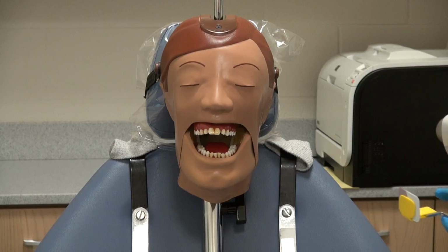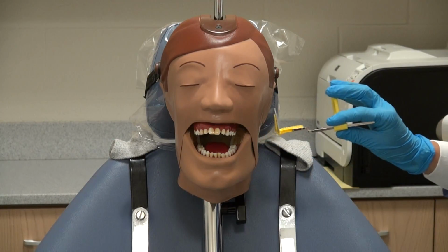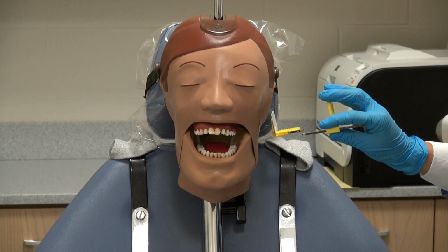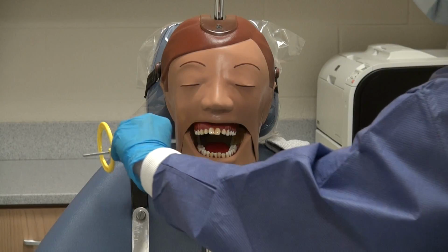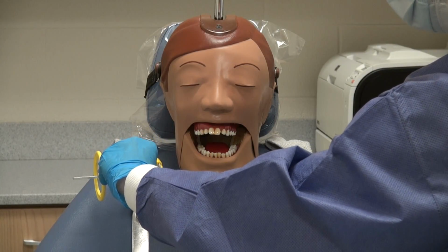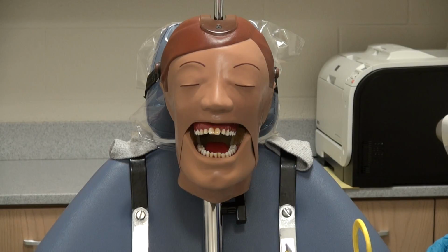We would proceed and take the premolar and molar image for the upper left quadrant, and then the premolar and molar images for the lower right quadrant, utilizing the film placements previously seen in today's session. Be sure to recalibrate at the control panel prior to each exposure.